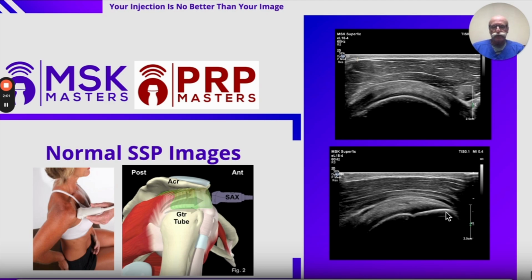Bony landmarks are always going to allow you to do the imaging in an efficient way, and also to do reproducible images from one patient to the next. Bony landmark here is the slope of the greater tuberosity. Little dip in the cortical margin here, that's the anatomic neck, and then the convexity you see here as we go to the left, or proximal, on this image, that is the humeral head.